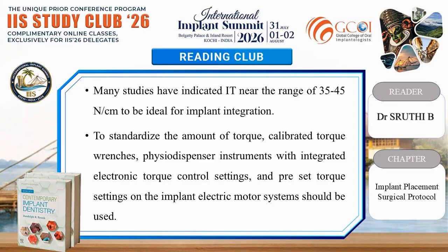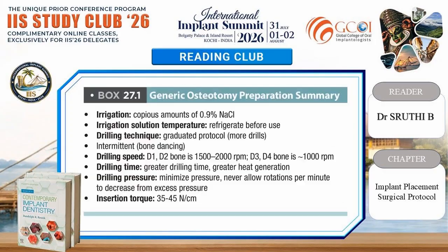To standardize the amount of torque, calibrated torque wrenches, physiodispenser instruments with integrated electronic torque control settings, and preset torque settings on the implant electrical motor systems should be used. Generic osteotomy preparation summary. Irrigation with copious amounts of 0.9% sodium chloride. Irrigation solution temperature: refrigerate before use. Drilling technique: graduated protocol, that is more drills. Intermittent, that is bone dancing.